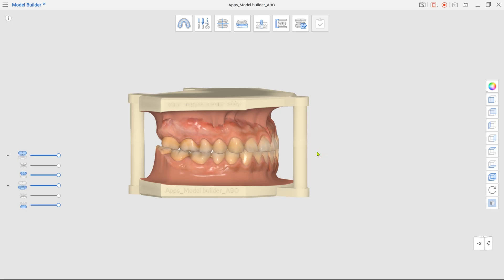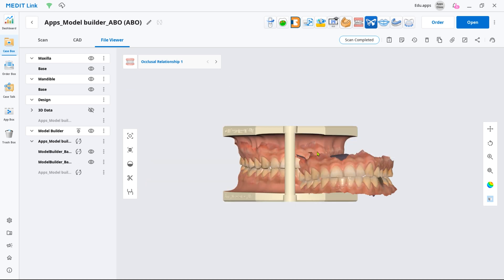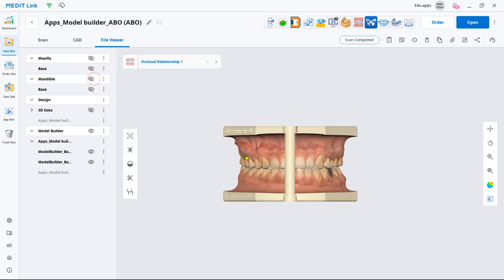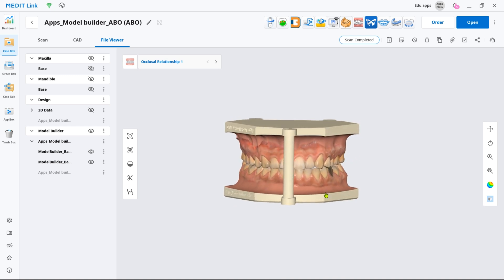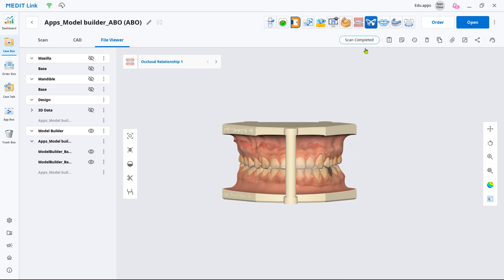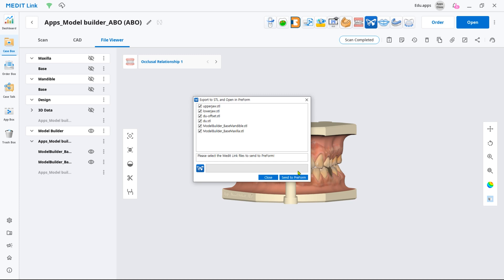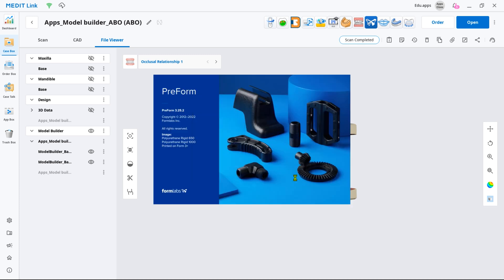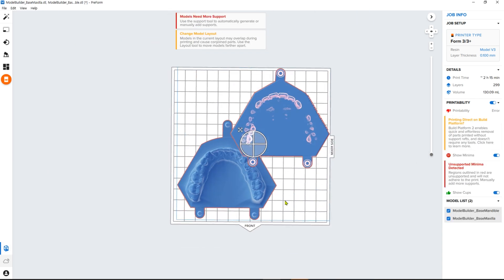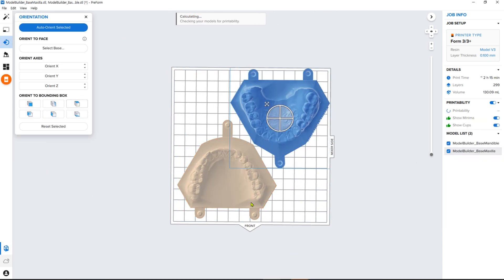Now you have a 3D printable model. If your 3D printer manufacturer has integration with Medit, you can find their app in our App Box. Install it to export the completed project file directly from MeditLink to that CAM software. Select the file you have just created and export it to prepare the model for 3D printing.